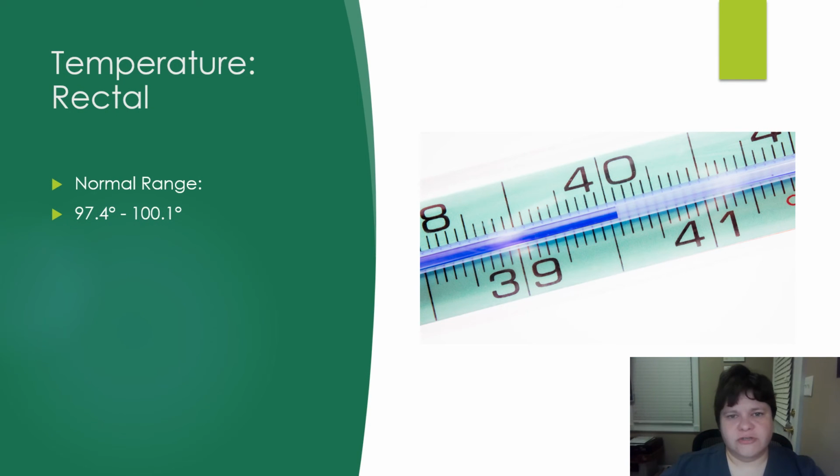Another way to take temperature is rectally. This is a useful way to take it if you need to know the core temperature of the person. You want to make sure that you're using plenty of lube when you put that in, for comfort for the patient. And you only want to insert it about an inch. Go any further, you could risk perforating something. This is a useful way to take it when you cannot otherwise take it orally or by any other means. Let's say you have a person whose mandible is fractured and they have their mouth wired shut.